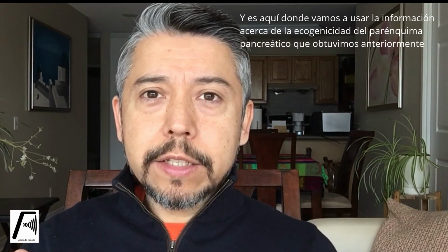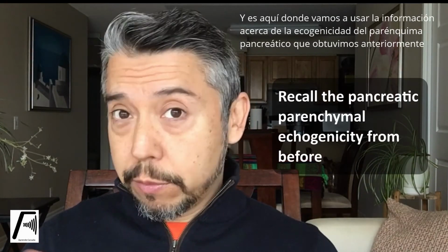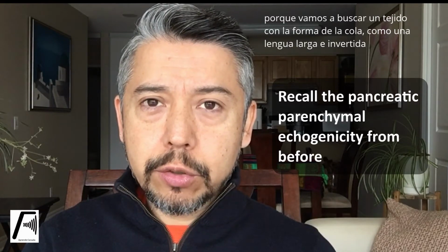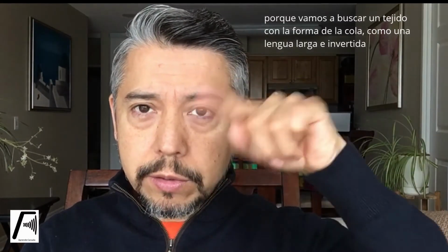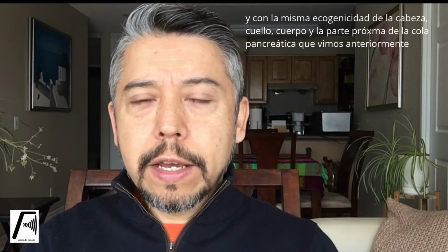Sometimes you will have to do some sweeping through the area. And again, this is where the information about the echogenicity of the pancreas from before comes in handy, because you're trying to look for a tissue with the shape of the tail. So it's going to be almost like an inverse tongue-like structure.